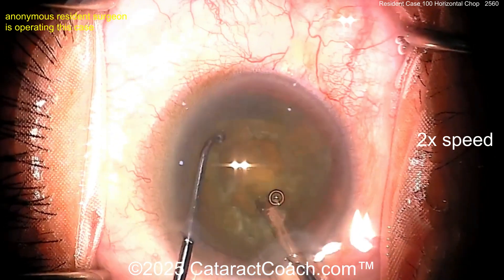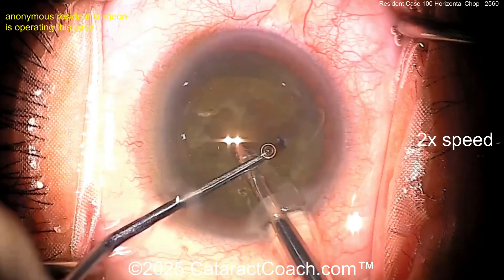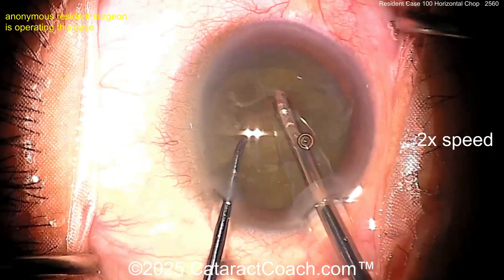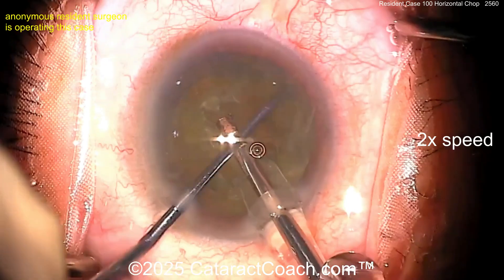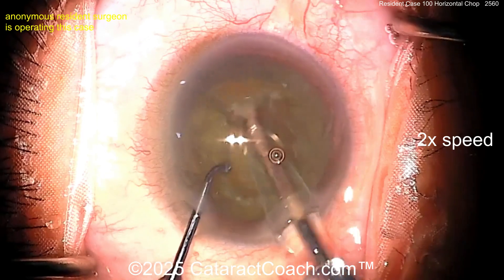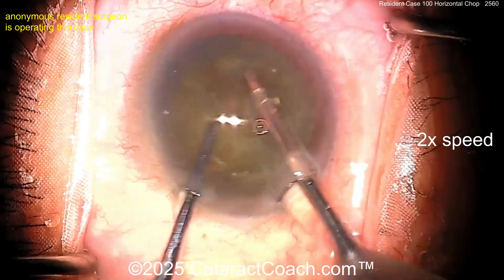The technique here looks like a horizontal ball-tip chopper on the left hand, buzzing with the phaco probe — the chopper goes around the lens equator. Look at that, so nicely done. We've sped the video up to 2x normal speed, but just the way this surgeon moves his or her hands is fantastic. I'm really impressed for a hundred cases.